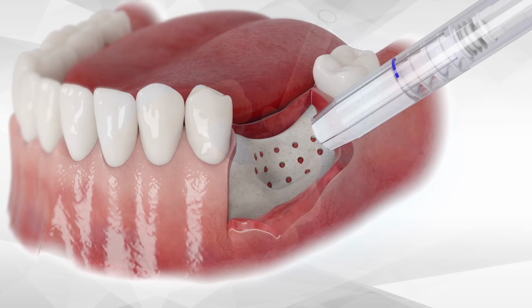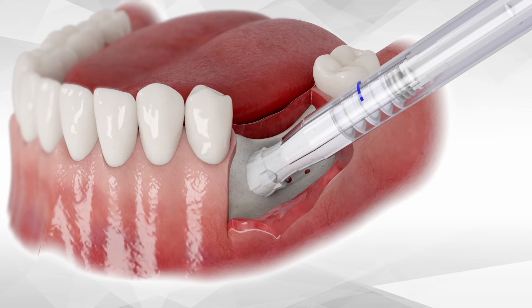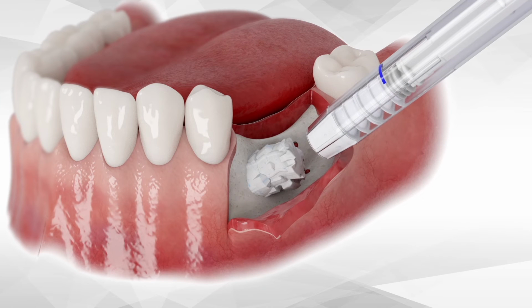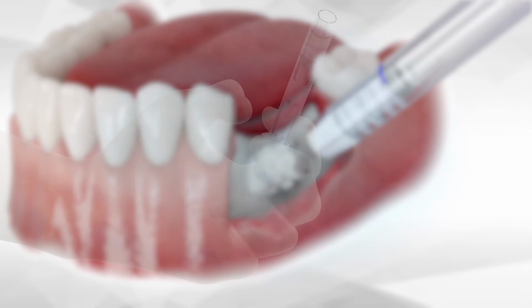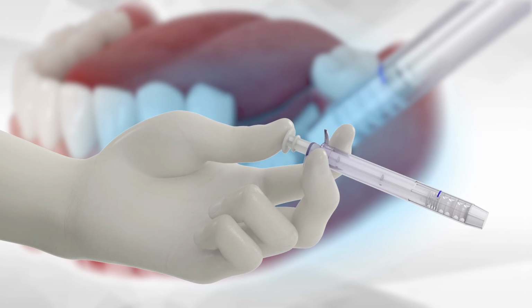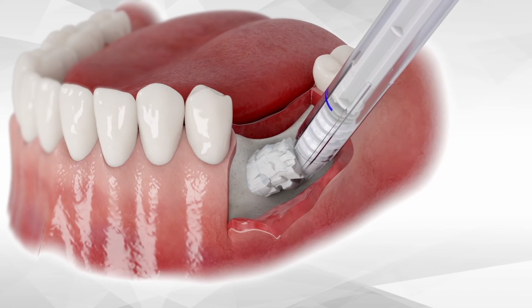Approach the site in a 45-degree angle and start ejecting the cement into the site using the head of the syringe in order to stabilize the cement in place. The cement is deployed into the site until it stops, and then the position is changed to use the thumb in order to expel the rest of the cement into the site.